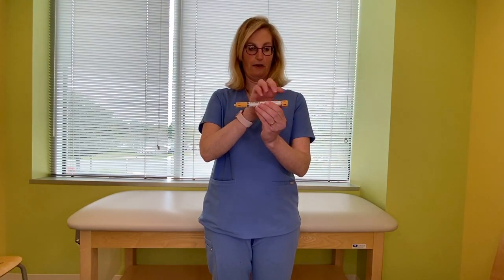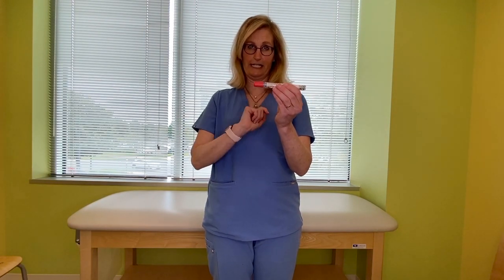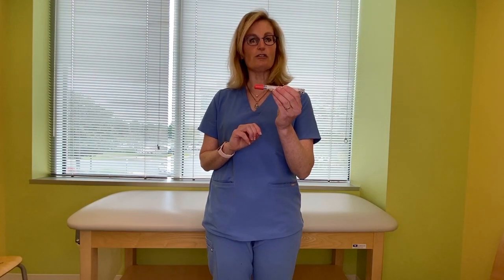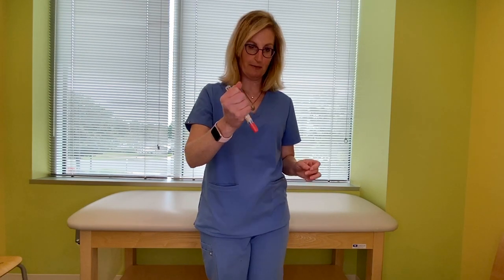This has two caps that come off — one on one end, one on the other end. You can easily guess which end is going into your body: it's this red tip. This pen actually goes in for 10 seconds. So you're going to hold it with your fist, just as you did with the other EpiPen, and into the thigh.